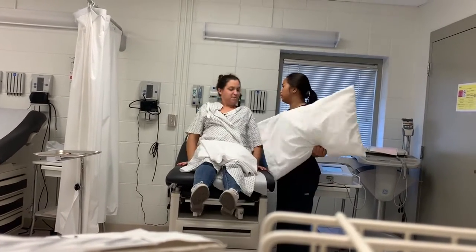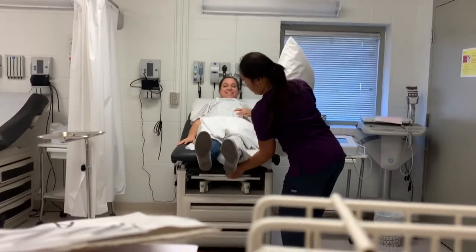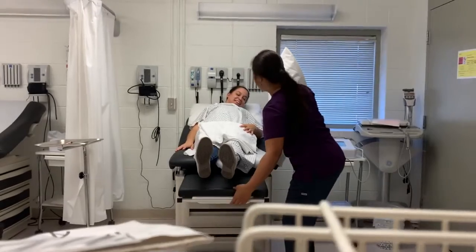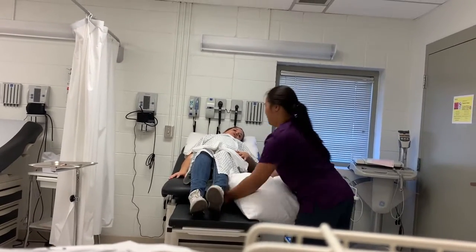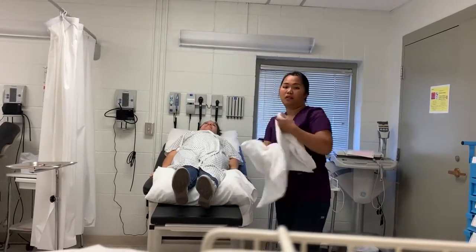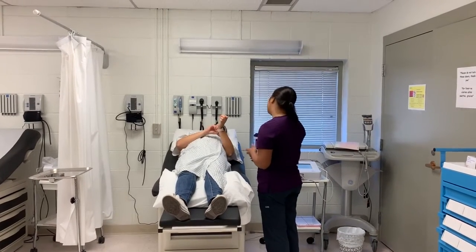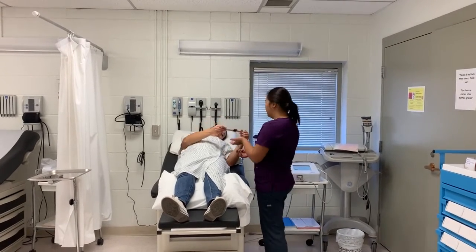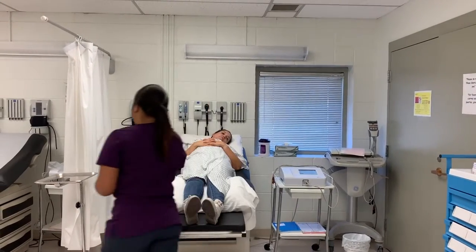Do you want an extra pillow? Sure. Do you have any electronics with you right now? They might interfere with this. Okay, I'm going to place this where she can see it.